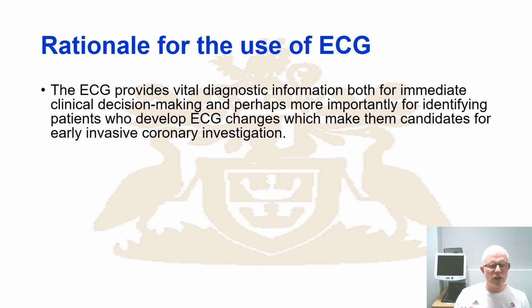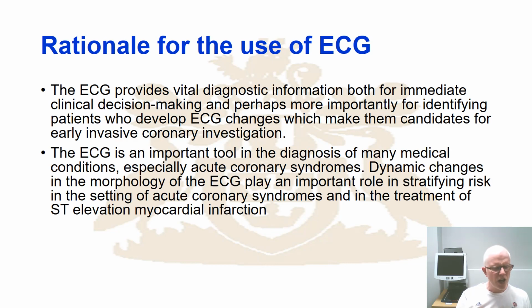This really alludes to the idea that you can actually identify key pathologies and you can track somebody's ECG over time. You can look at threshold values, and actually based upon that you can identify these individuals are probably going to go forward or have to go forward for some form of cardiovascular intervention, so some kind of surgery. So that really sets out the classic role of the ECG. Coupled with that, it is very, very useful in diagnosing medical conditions.